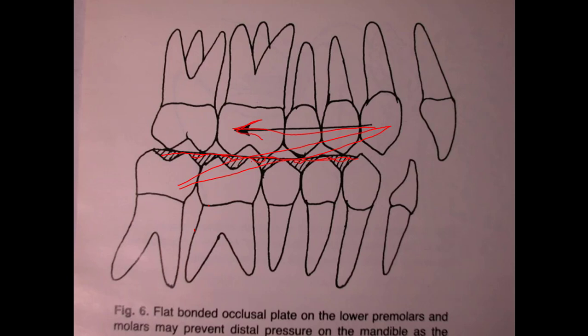That will help you in correcting your Class 2 problems or your Class 3 problems if you're dragging them either way, where they've got steep cusps. If you just cover this area down here where the cusp cannot lock them in the position they're in, and you want to move out of that, they won't have any problem because it just doesn't have any effect on the joint back here. Now, this is a little trick that you really ought to know about.